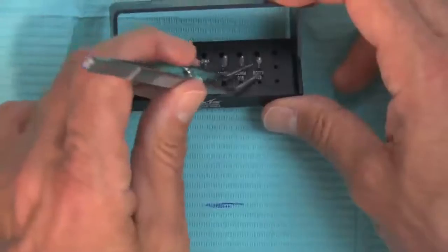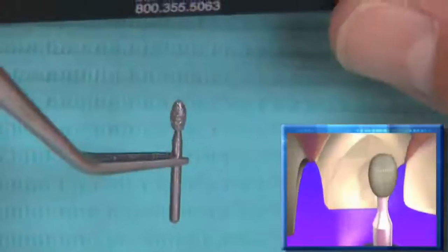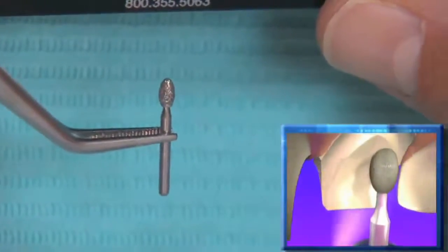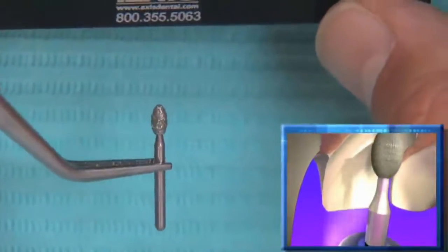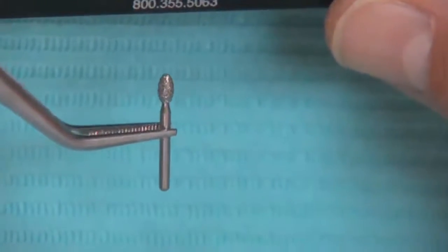The last thing we need to do is the lingual reduction, using the 379023 football diamond — also in super coarse. I like super coarse burrs because by virtue of the fact they remove more tooth structure, they create less pulpal heat and allow us to prep more efficiently.